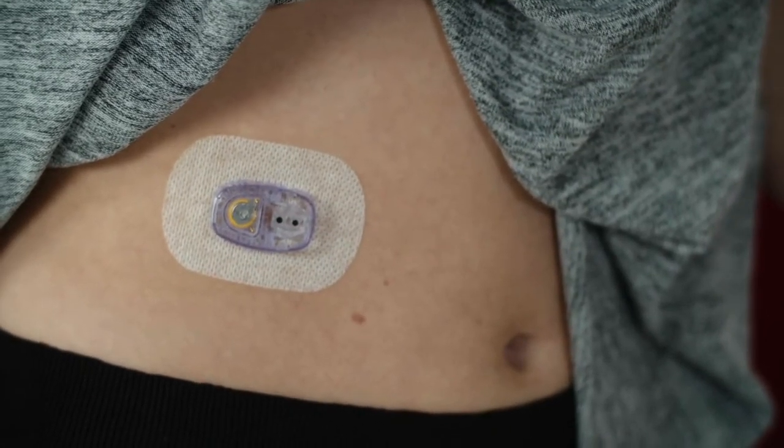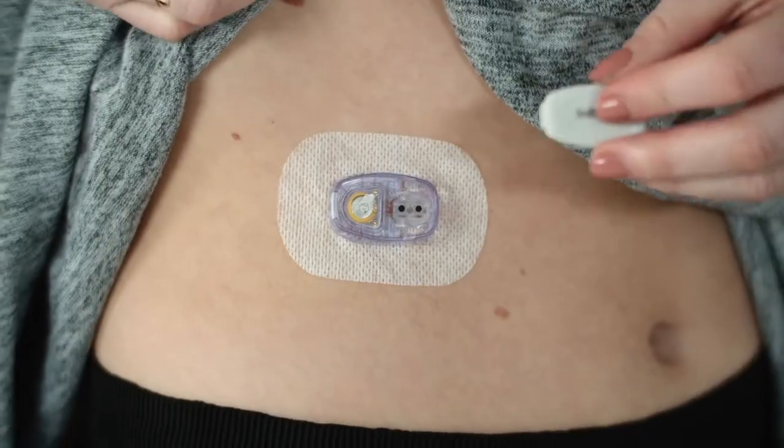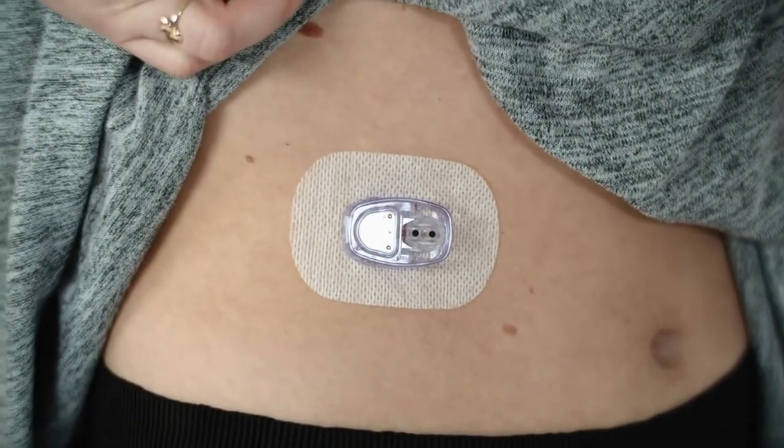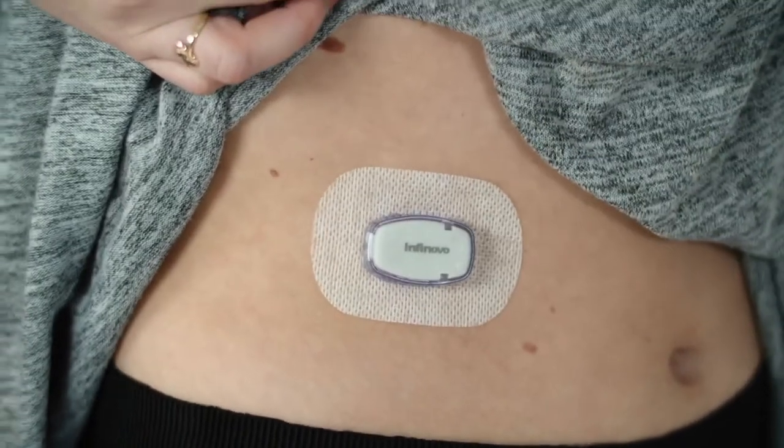Hold the applicator in position for 5 seconds, which sticks the sensor to your skin. And hey presto — the sensor has been applied; wasn't that easy! Now apply the transmitter to the sensor bed. Listen for the clicks — the clicks indicate that the transmitter has been fitted correctly.